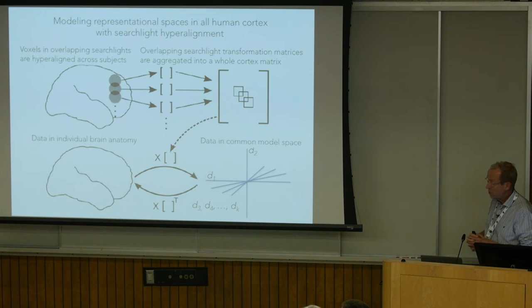And the Procrustes transformation was designed by engineers, applied mathematicians, who really don't care about what it's rotating. So they will take data from any place in their region of interest and rotate it into locations anywhere else in that region of interest. And that's a real problem. So for example, it could rotate the right temporal lobe into the left occipital lobe.